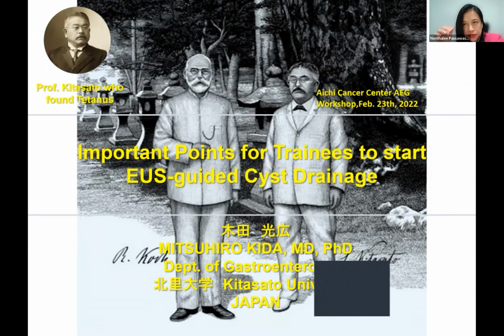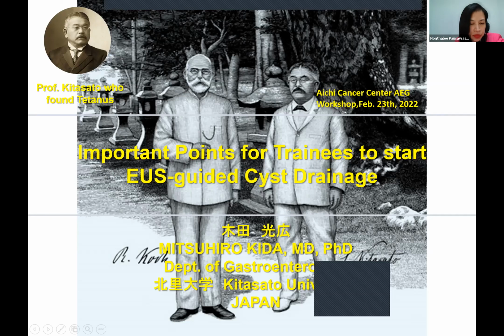The other technique that I've used for a very small lesion and hard lesion is the door knocking technique. I would measure the size of the lesion and set the stopper just right where I want it. Then I would jab the needle in real hard and slowly pull it back within the lesion and then jab it in again. I would keep doing that for about 10 times. It's very difficult for small lesions to do the fanning technique. So if you can apply fanning, it's good. If you can't, then the jabbing, door knocking technique would be good.